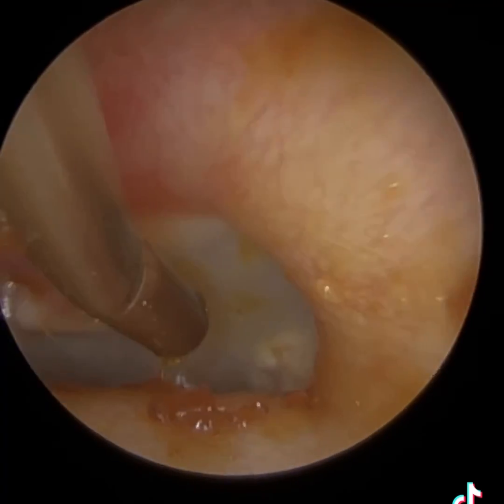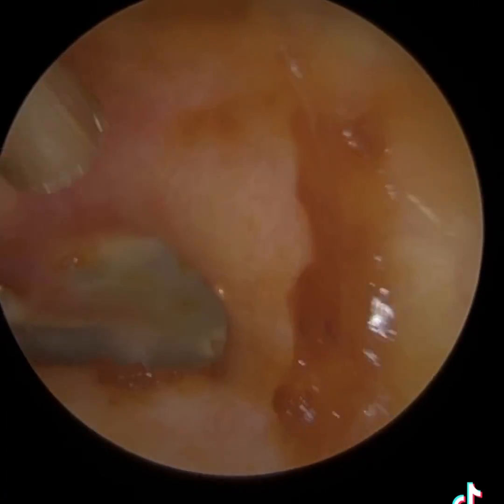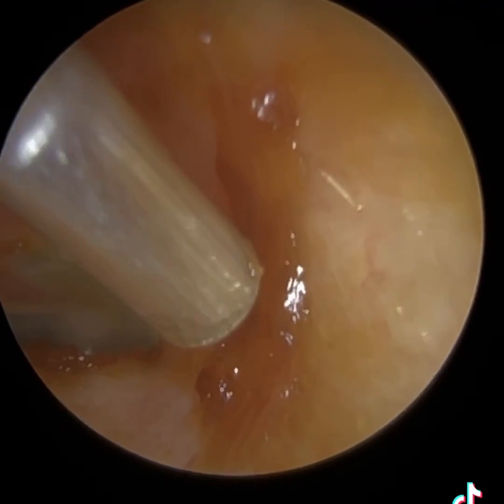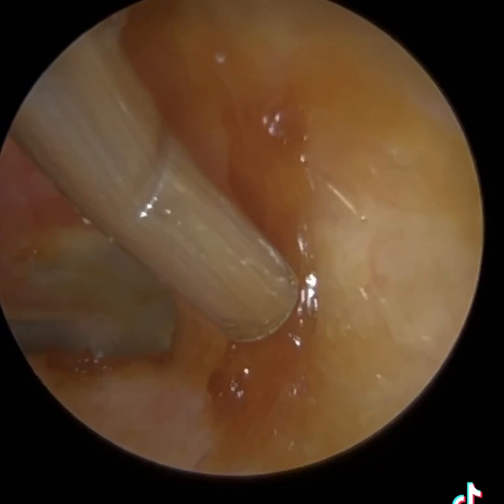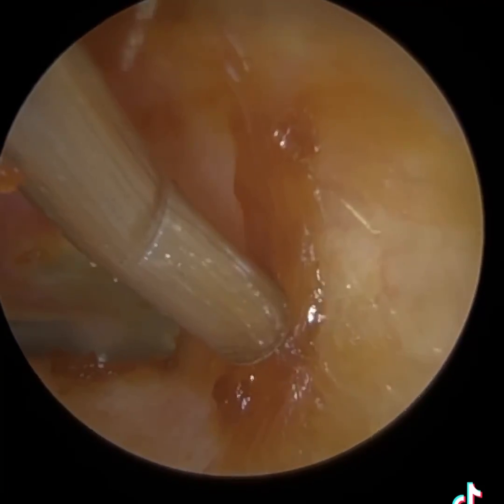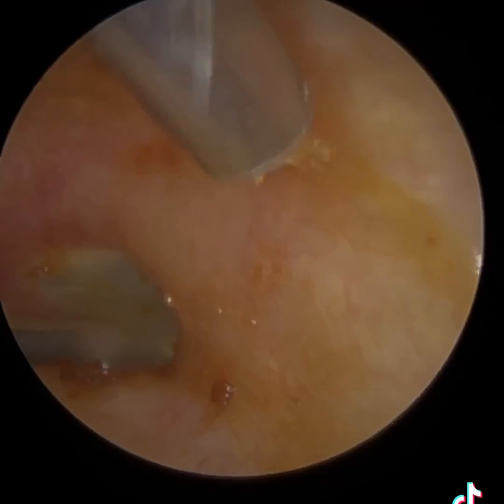You can see I'm just hovering over. The patient has got a bit of scar tissue at the base of the eardrum — you'll see that in a moment. So I'm just going back for this; I just want to, within half a millimetre, just hover over. And we do manage to get this. There we are.